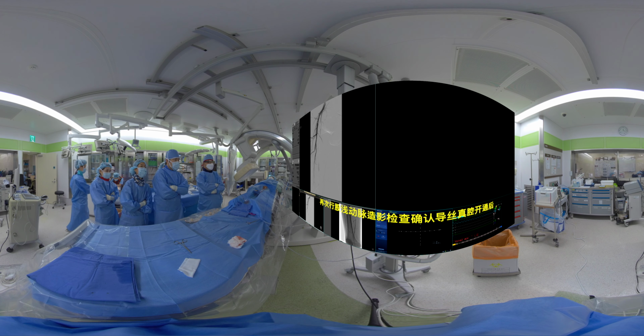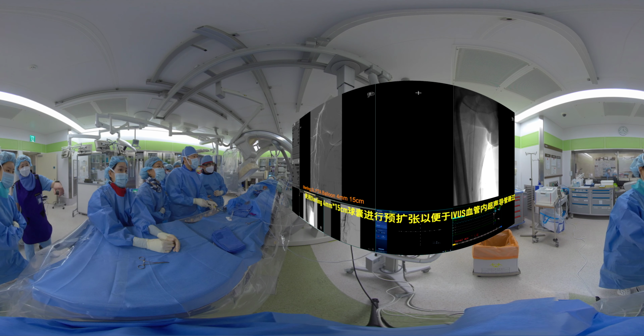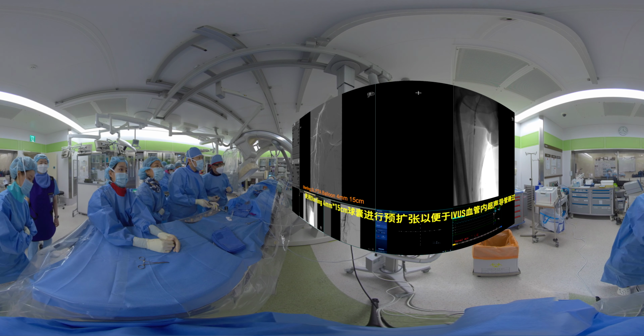After checking the angiogram of the SFA, pre-ballooning was performed with a 4 mm, 15 cm PTA balloon for easy passage of the IVUS catheter.